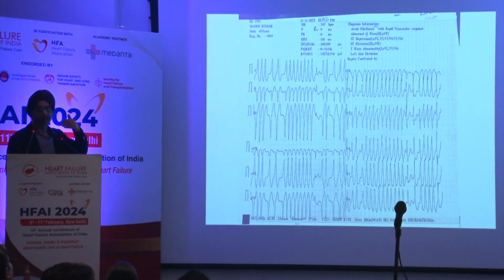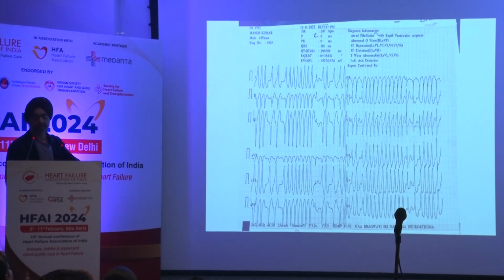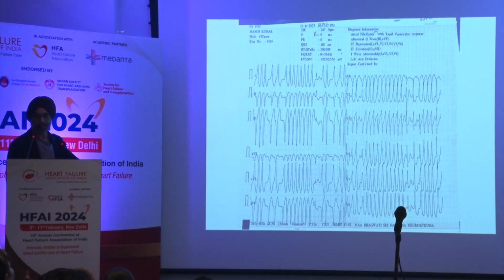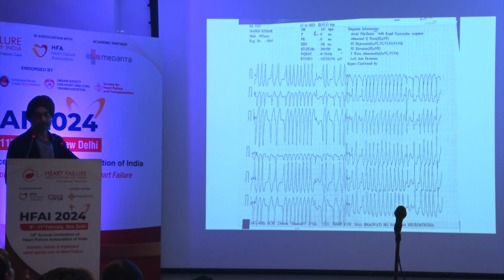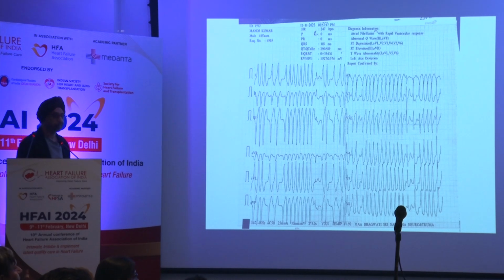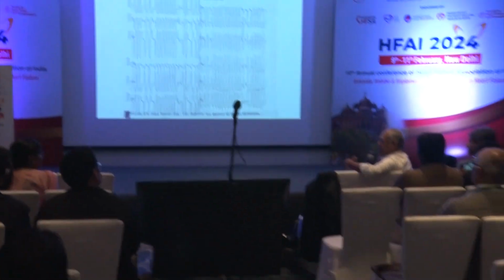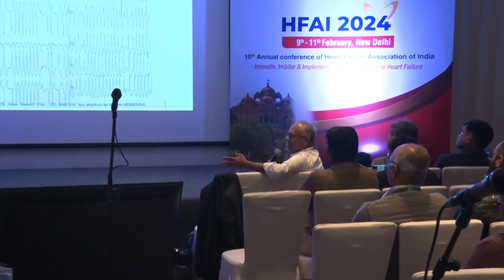Before we go to Narasimhan, any questions from your side? Because this is something which should be memorized by you. This ECG should be a part of your life. As long as you practice cardiology, you should not make a mistake again on this ECG. Yeah, this is a life-threatening emergency and the patient can be completely cured. This is one situation where ablation is a curative option.